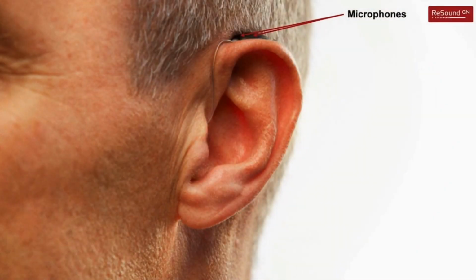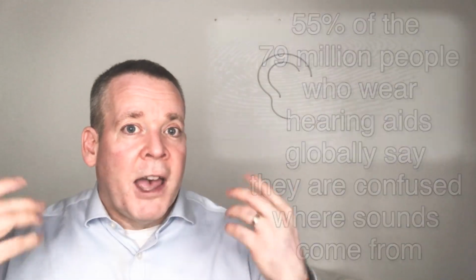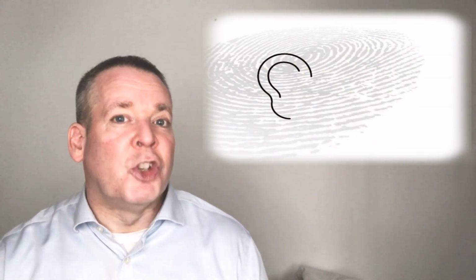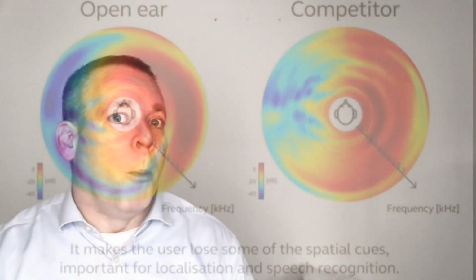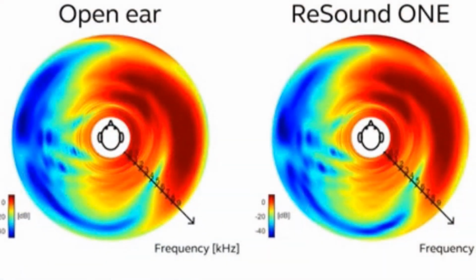Let's look at the design of the ear, designed to funnel in sound from the front and reject it from the rear. And also, ears are sort of like a fingerprint. They're unique to each individual. So the things that affect how I hear, my head, my torso, my ears, are going to be different from yours. So if you put a hearing aid behind the ear, you actually get rid of what we call the pinna effect. This can affect things such as localization, meaning knowing where a sound is coming from. And if you're hearing impaired, it might be important for you to know where that sound's coming from so you can react appropriately to it.